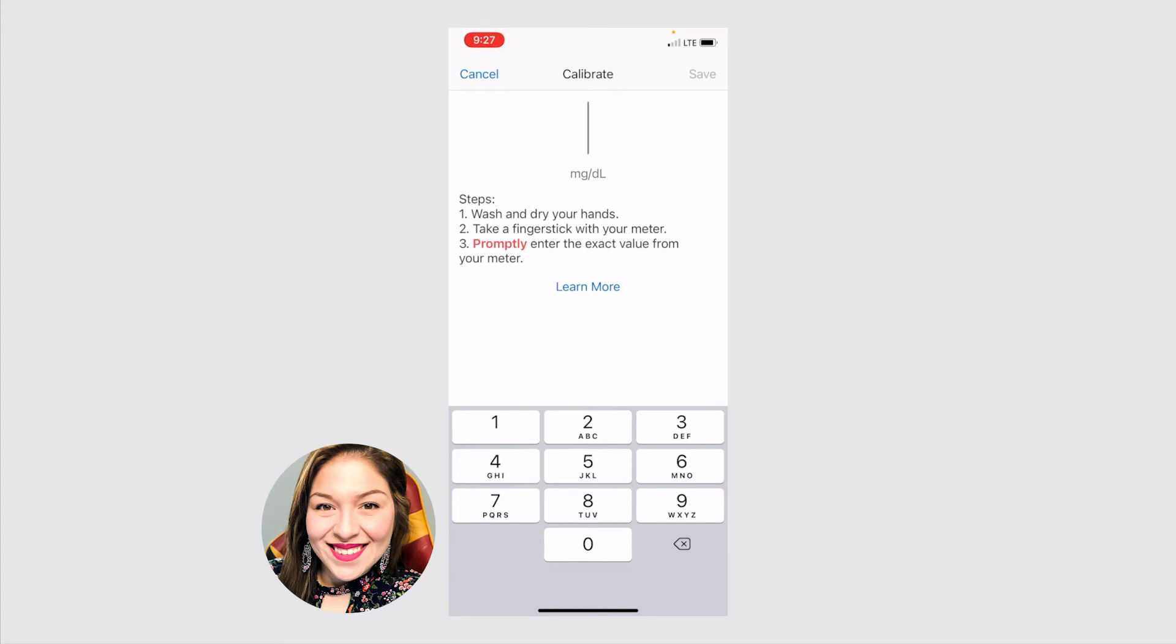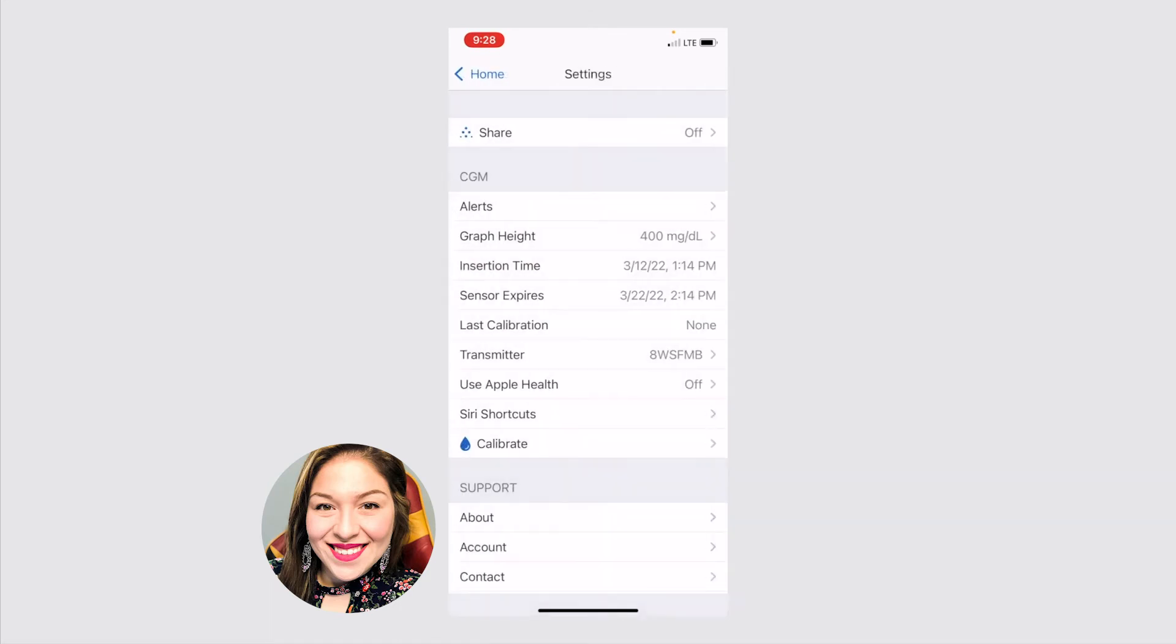You just follow the steps here of washing your hands, taking your glucose readings as you normally would, and then enter it. And the software will make sure that it's calibrated to what your sugar readings were. And it makes your readings as accurate as possible.